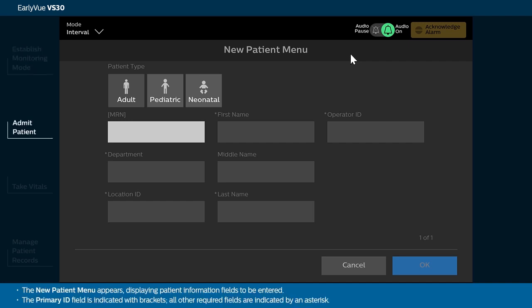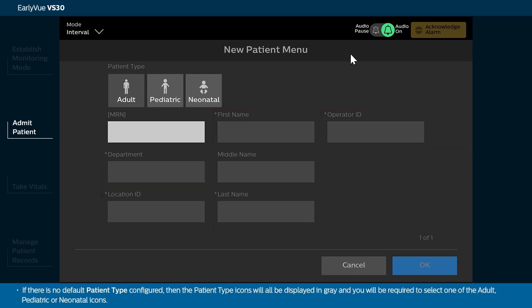The New Patient menu appears, displaying patient information fields to be entered. The Primary ID field is indicated with brackets. All other required fields are indicated by an asterisk. If there is no default patient type configured, the patient type icons will all be displayed in gray and you will be required to select one of the adult, pediatric, or neonatal icons.